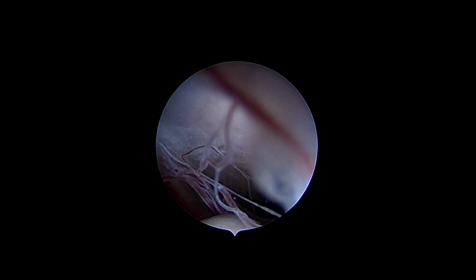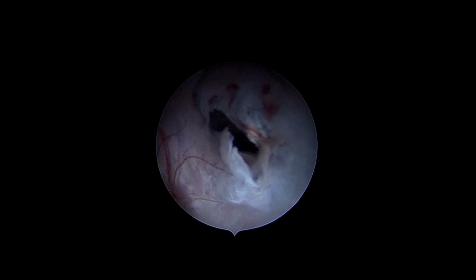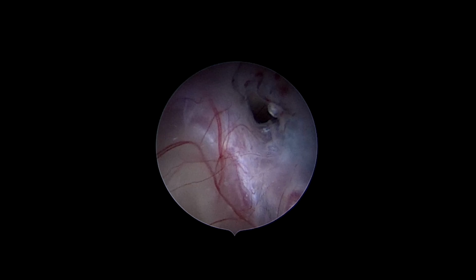Basilar top. The floor is nicely flapping, which indicates the flow of CSF through the stoma.